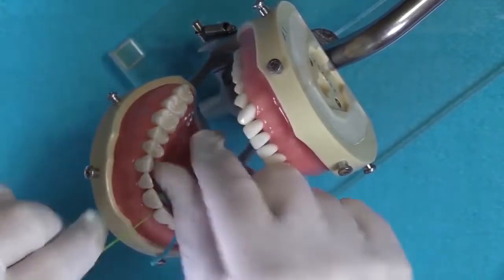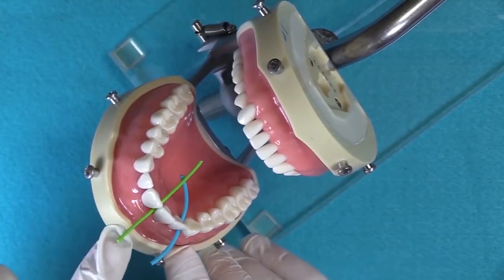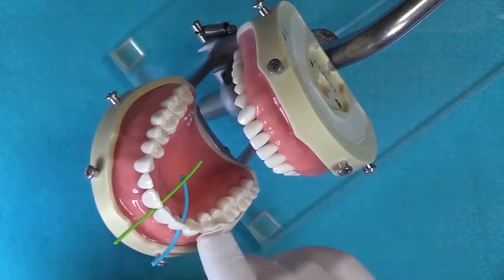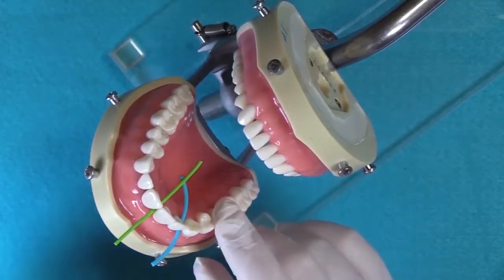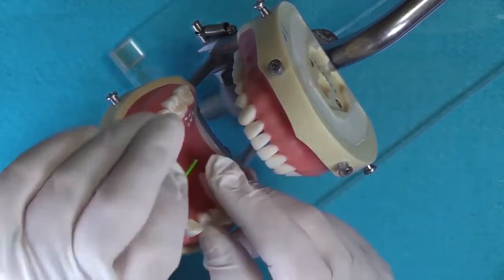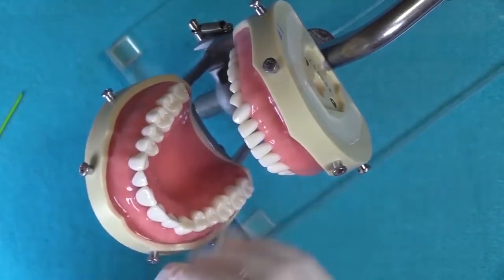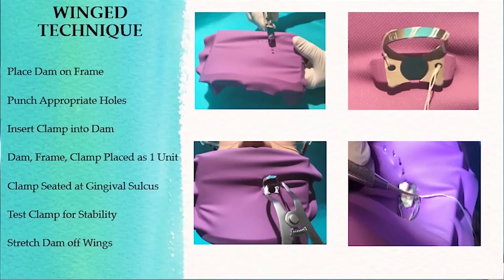So if you can see that the lime green is size small because it's thinner, and the turquoise is large. The yellow is small in the latex version, and the orange is large in the latex version. So these can be used in place of using a clamp, but you do need a contact in order for those to work. What we're going to do now is a demonstration of how to properly use a wing clamp.